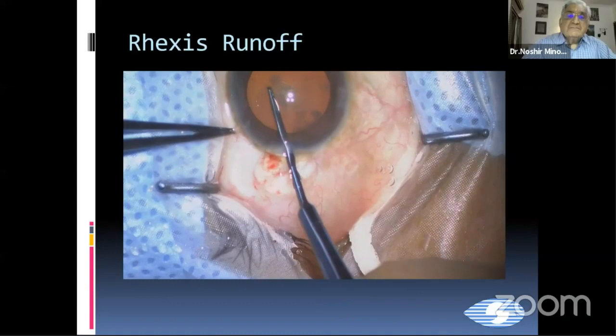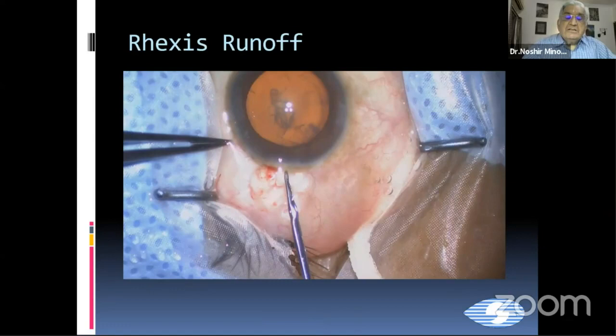In this case, you have to maintain a deep chamber and use a 23-gauge forceps, which can go through a 1.2 millimeter incision, so that you can maintain a deep chamber throughout. This is very necessary, and this is where the 23-gauge forceps are very, very useful.